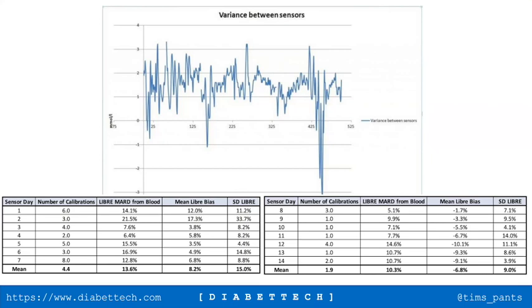Do you have any comments regarding using extra smoothing on xDrip with Libre to try and get rid of some of the noise? So I've never used Libre with an APS system. Extra smoothing is an interesting one, because I don't understand how you can use smoothing without it being retrospective. So if Milos is still on, I'd be happy to hear his views on that.